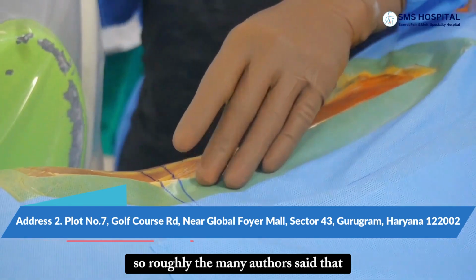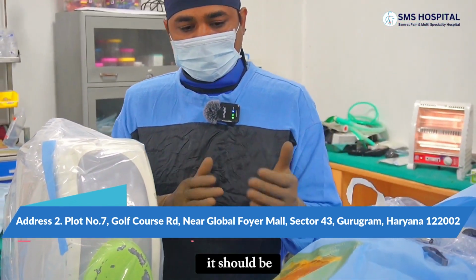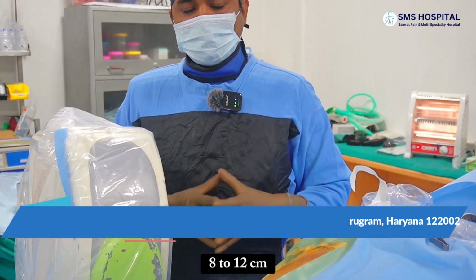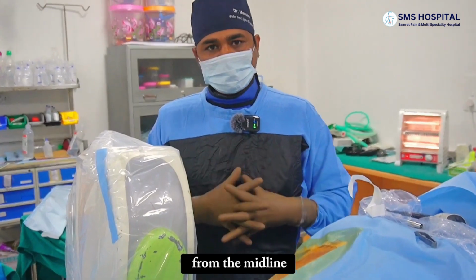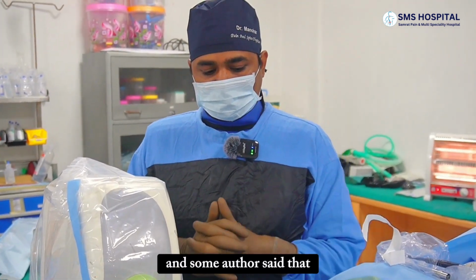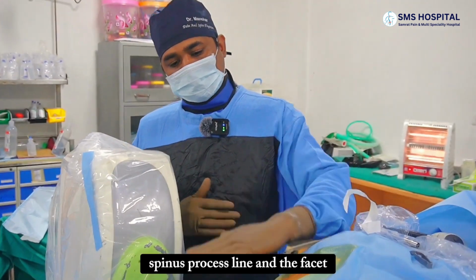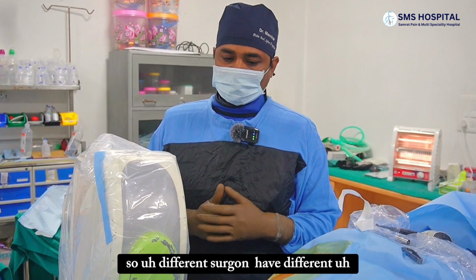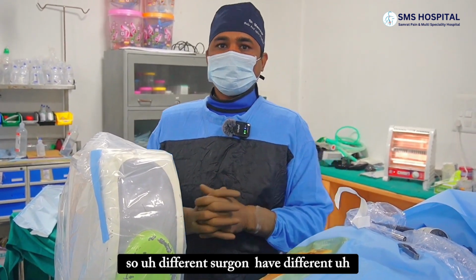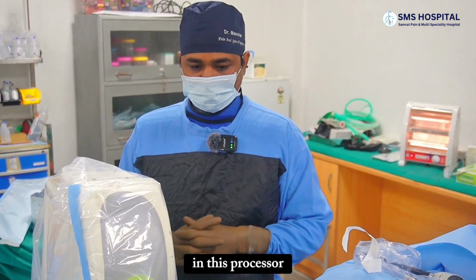centimeters. Many authors say that it should be 8 to 12 centimeters from the midline, or 9 to 11 centimeters from the midline, and some authors say that it should be between the spinous process line and the facet process line. So different surgeons have different methods to mark the entry of the needle in this procedure.